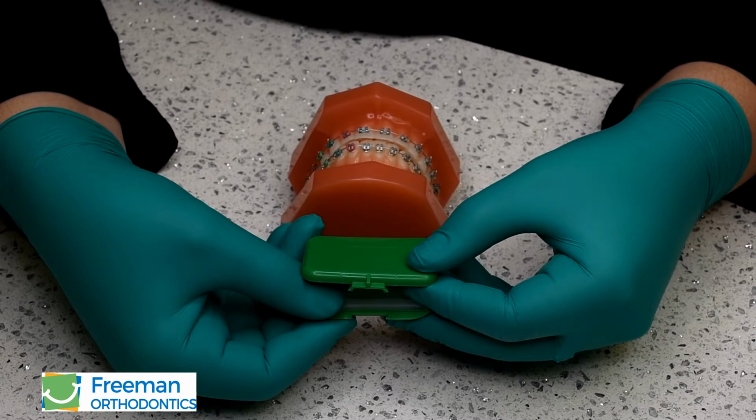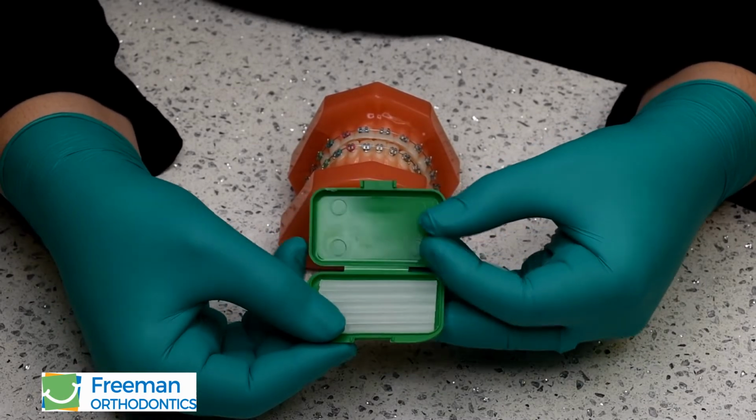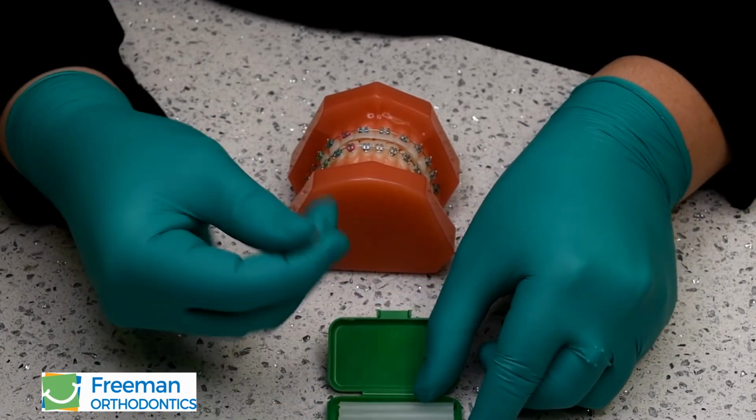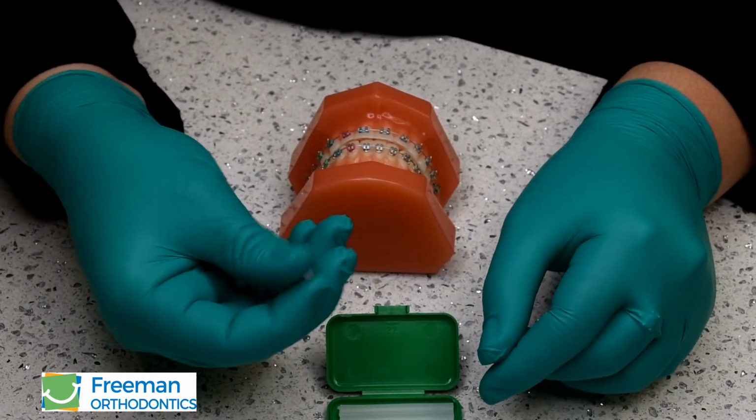Your lips and cheeks are going to have to adjust to your new braces. We have provided wax to help with the transition. Take a small piece of wax and roll it into a ball. Then place in the area of discomfort.